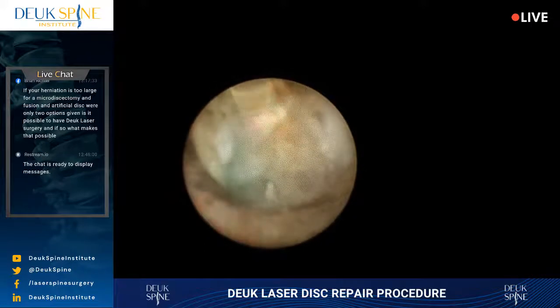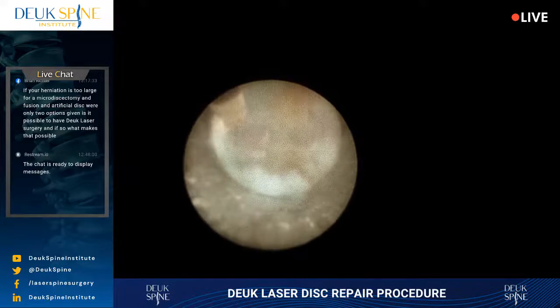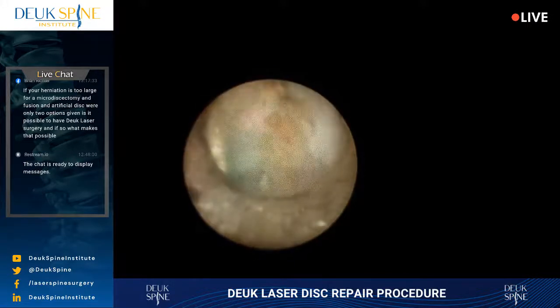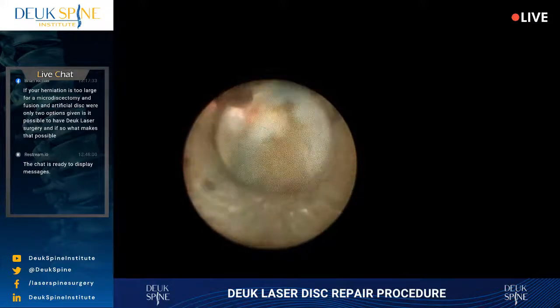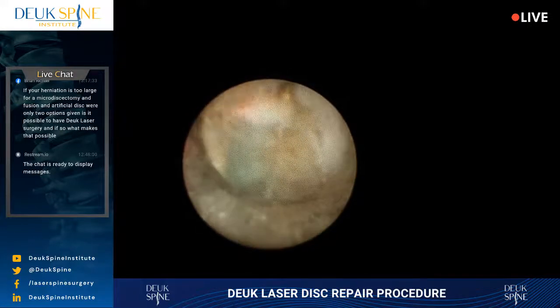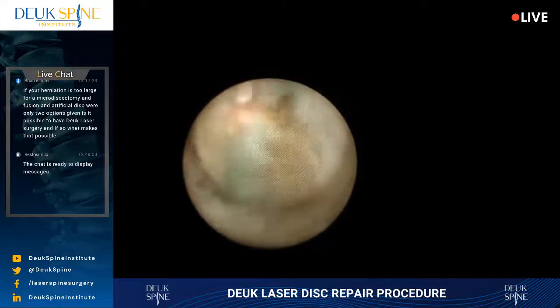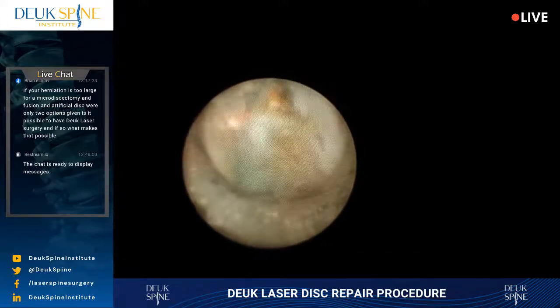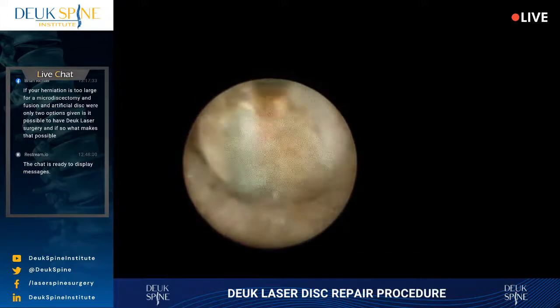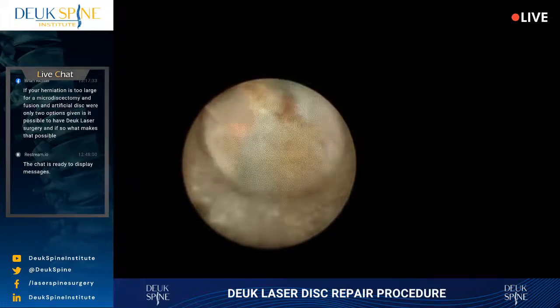Any questions from our audience? Yes, our first question comes from Facebook. A viewer asks, if your herniation is too large for a microdiscectomy and fusion and or artificial disc, were only two options given, is it possible to have the laser surgery? Yeah, great question. I understand it to be, if your herniation is really too big, can you still have the laser surgery? The answer is yes.